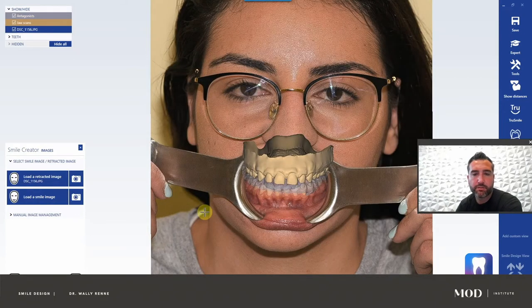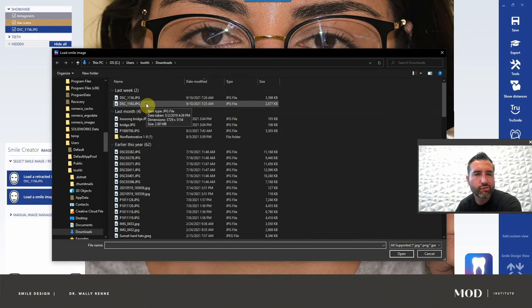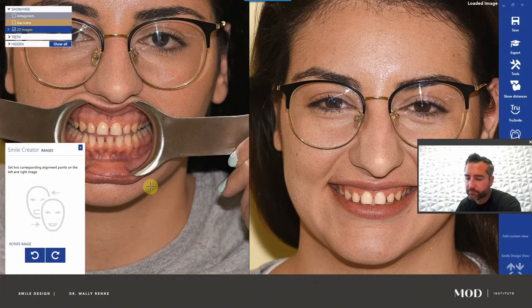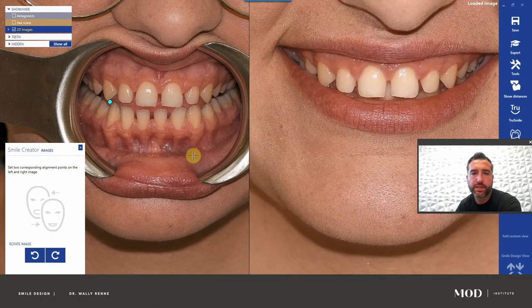Don't worry — the lowers never line up, obviously, because she's not in maximum intercuspation for this retracted photo. Now load a smile image. This is where we really screwed up photographically. If you look at these two images, they're not at the same angle, and they're not at the same focal length. Always use a fixed prime lens — don't ever use a zoom lens. That's just not acceptable for dental photography. You want a one-to-one ratio.